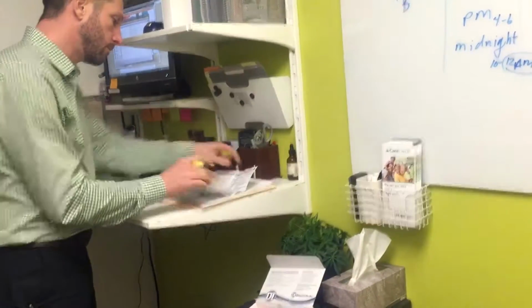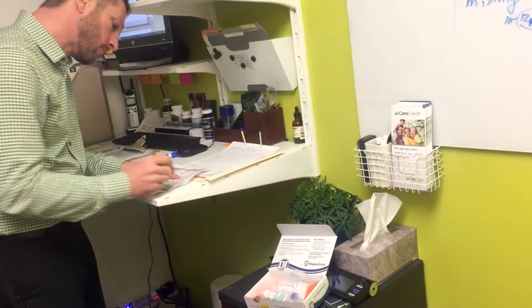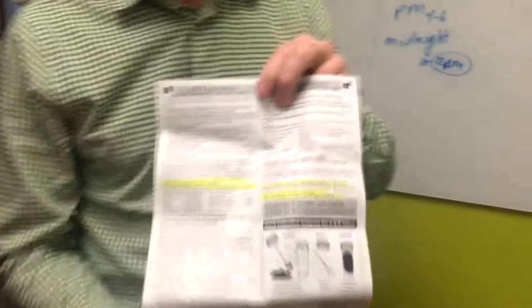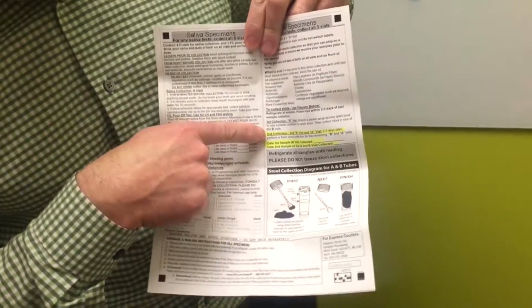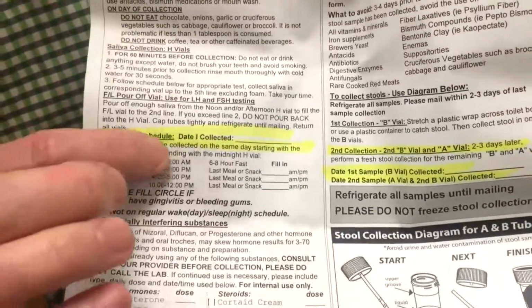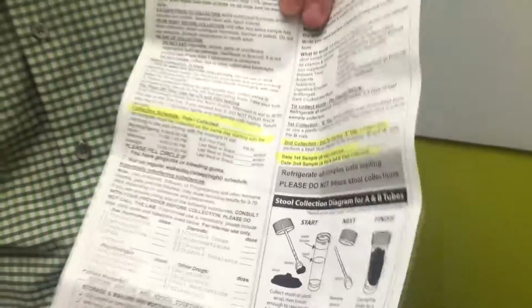And I'm highlighting those. So on the form, I'm going to show the video here real quick. On the form on this side with the picture about the stool, you're going to mark the time that the stool collection was collected right here. And then for the saliva over here, the collection date is here. The basic written instructions for each one.